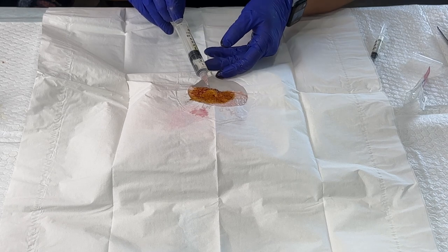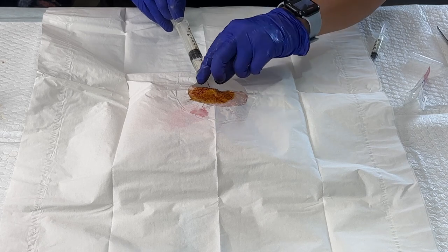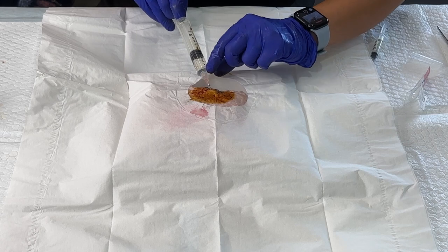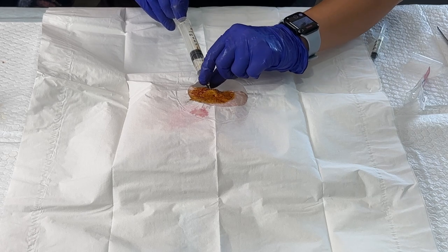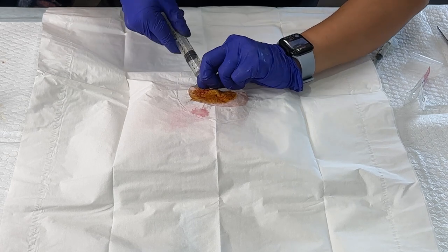Now, if we were going to be injecting something like a steroid within the cyst to help prevent it from recurring, we could do so by undoing this needle and then attaching the syringe with the medication to administer it — you could do that sort of like this.